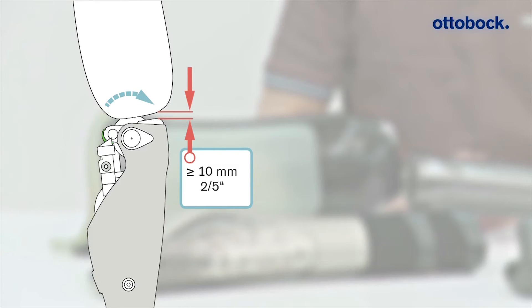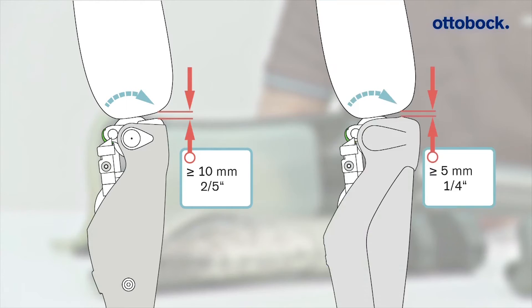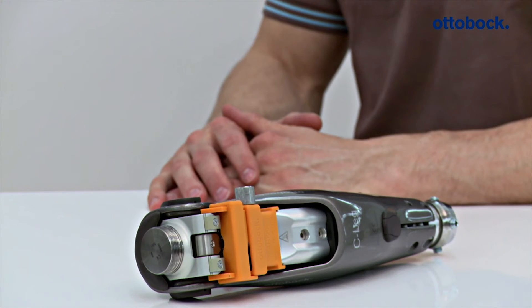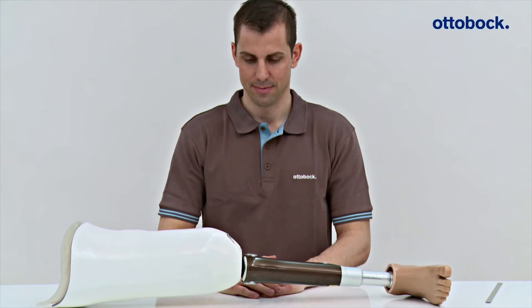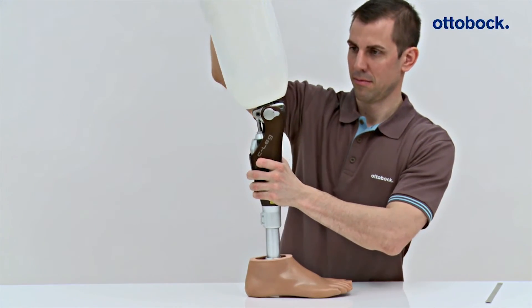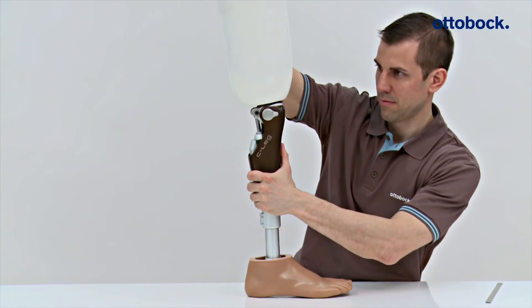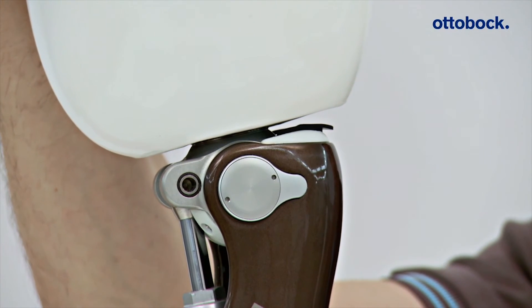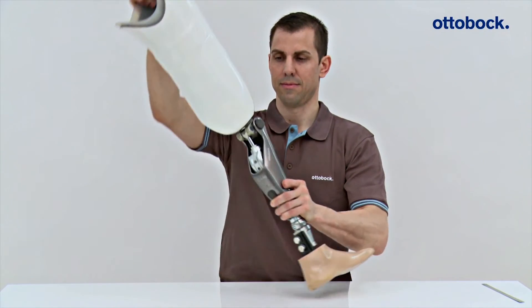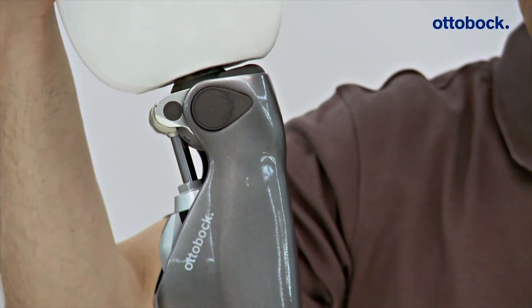This is necessary as an installed protective cover reduces the available space by five millimeters. Particular caution is required when a C-Leg from a previous generation is replaced with a C-Leg 4. Due to the additional extension potential of the C-Leg 4, switching knee joints could result in contact between the socket and main electronics, even when there was sufficient distance with the previous fitting. This is particularly important during trial fittings.